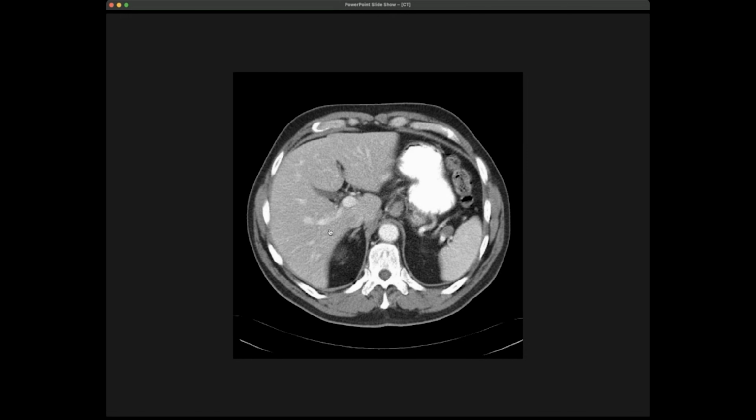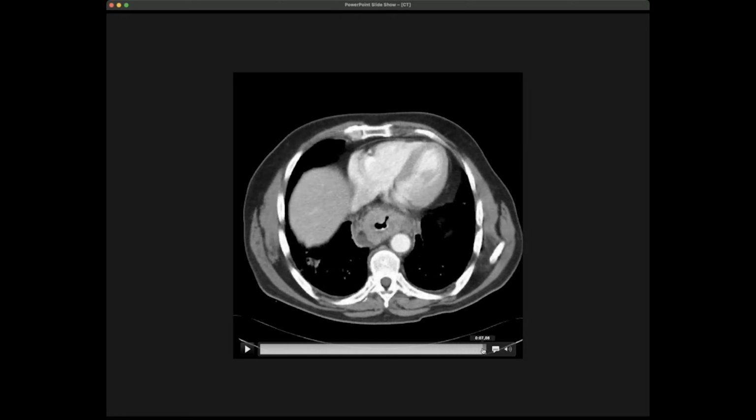What radiologists do when they look at scans is they actually look from the toes to the head. So you look from below and you look upside. So you always look at the cut of the body from below. And so obviously when you look from below to the liver of a person who is lying on the back, then of course the liver would be at the left side. So you always look from the feet to the head when you do these scans. That's conventionally the way that you do it.